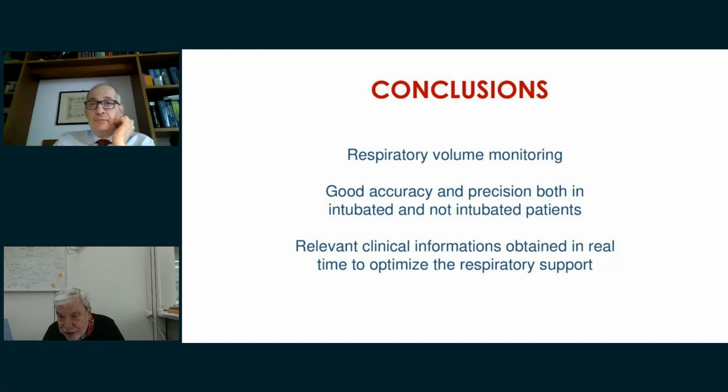Davide, can you also say how to measure this for patients on nasal cannula? Yeah, in the same way as Professor Gattinoni told us. We can put in an esophageal balloon, or we can get some idea by putting a probe into the nose during nasal cannula, on the other side of the nose, and you can see a change in the pressure.